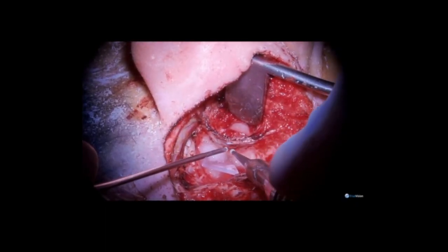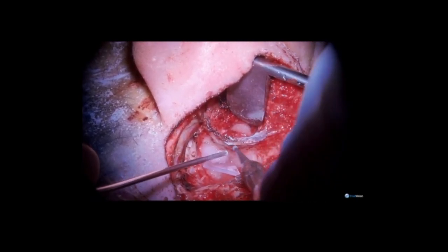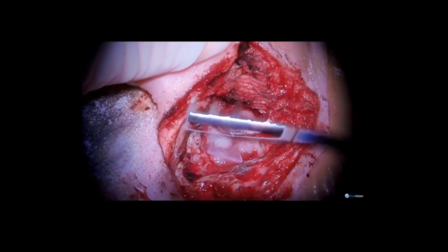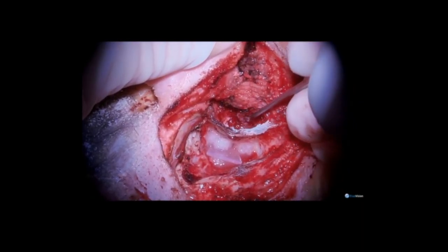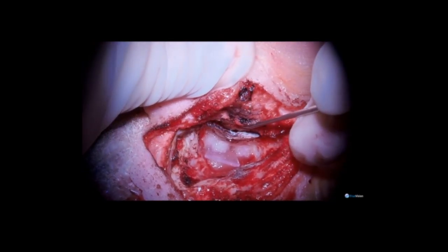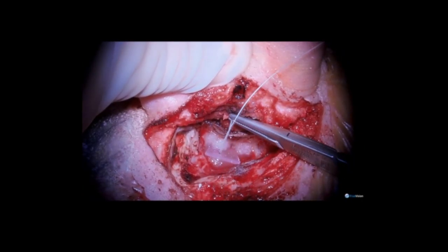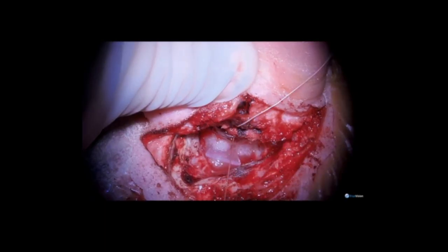Prior to reintroduction of the Kerner's flap, I am drilling a lateral tacking hole so that I can grab some of the soft tissue which serves to support and drive the Kerner's flap position to the most medial extent. First, I will make sure that the Kerner's flap is in good position, overlying the graft. A Vicryl on a small needle is ideal for performing this tacking maneuver.